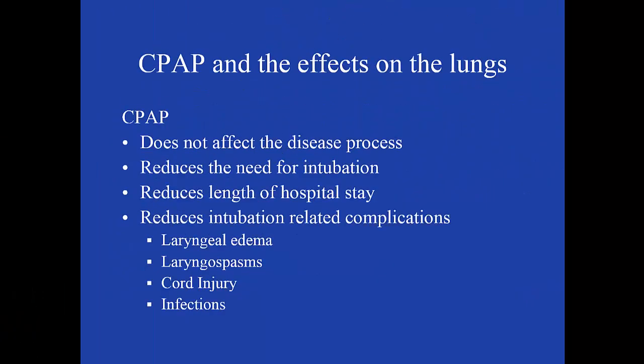There are some things that CPAP can and cannot do. CPAP does not affect the underlying disease process. If we were to remove a patient from CPAP, without additional treatment, they would quickly return to their underlying condition. CPAP does reduce the need for intubation and reduces the length of hospital stays. And because CPAP reduces the need for intubation, it also reduces the risk of intubation-related complications, such as laryngeal edema, laryngospasm, vocal cord injury, and infections.